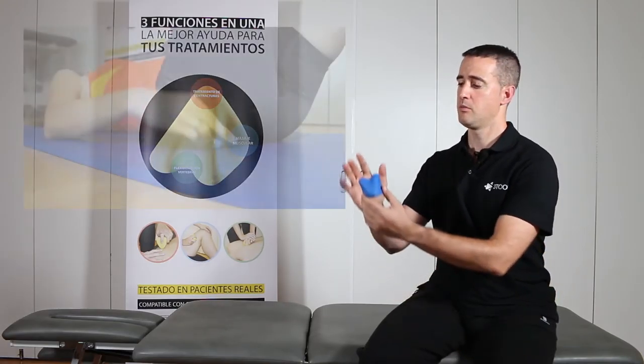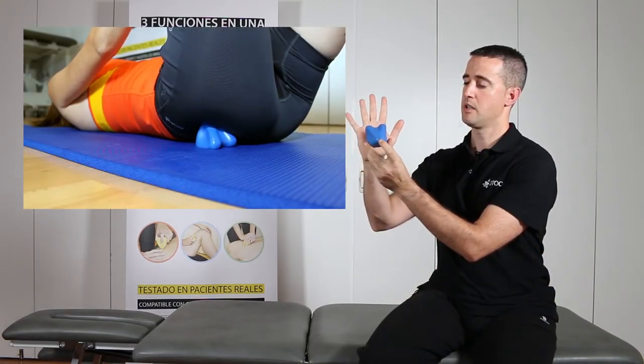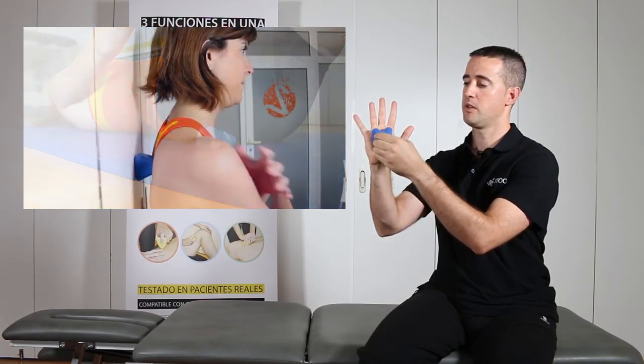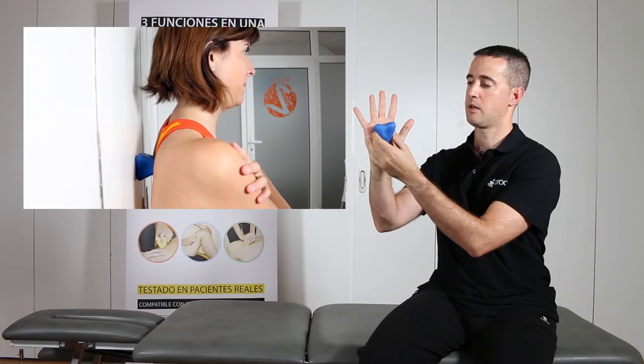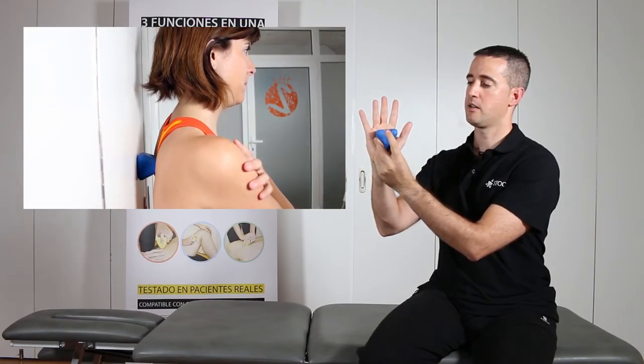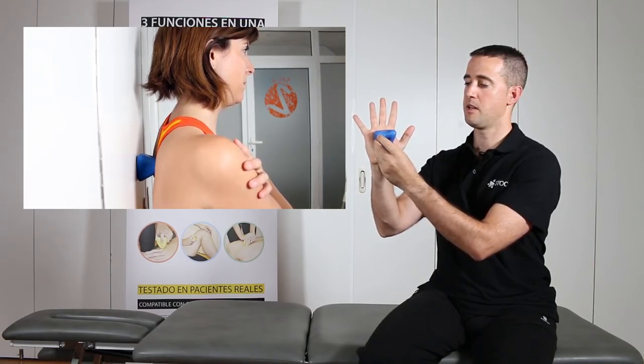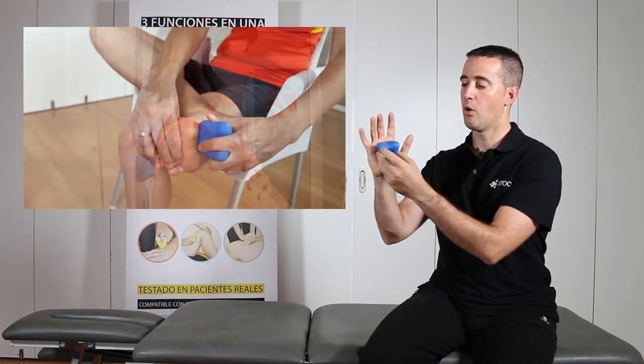3Tool is clearly also a very versatile tool for patients. They can carry out compression over muscle contractures, the tool providing a stable surface to lean against. Alternatively, modifying the position of the tool, they can carry out vertebral relaxation exercises or paravertebral self-massage, the support of the tool also providing great stability.